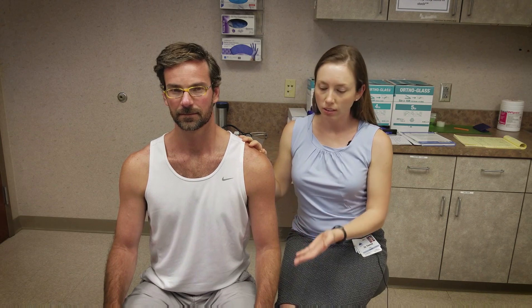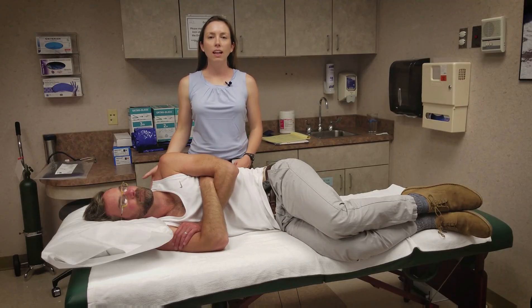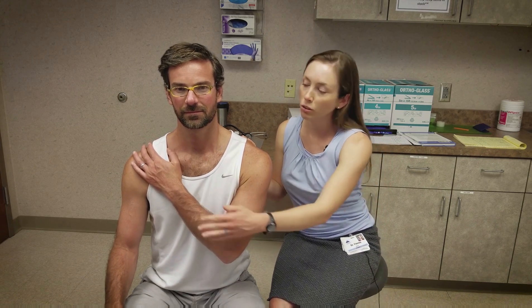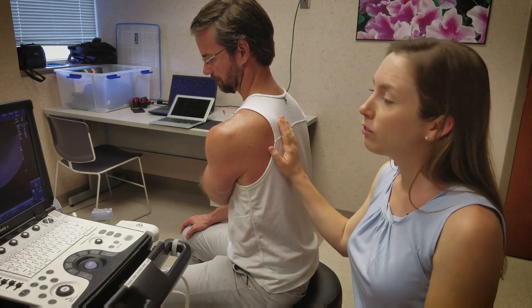There are two ways to position the patient: one is sitting in the upright position so that the provider can manipulate the shoulder joint, or lying in the lateral decubitus position if you're concerned about your patient fainting. The patient's ipsilateral hand will rest on the contralateral shoulder. The provider will be behind the patient with a clear view of the ultrasound.